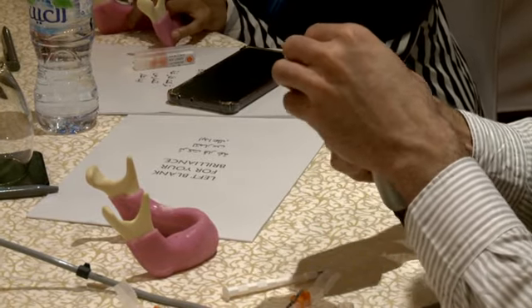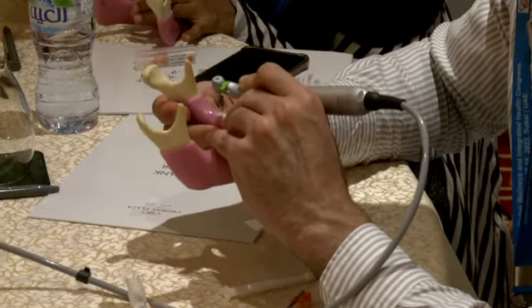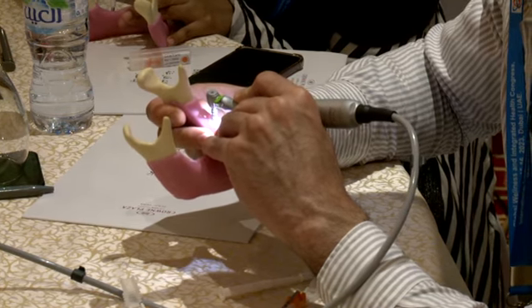And in an ideal case scenario, you would like to do this guided, right? But in this case, we can use freehand as well, as you know the parameters for the bone, where the bone is located.